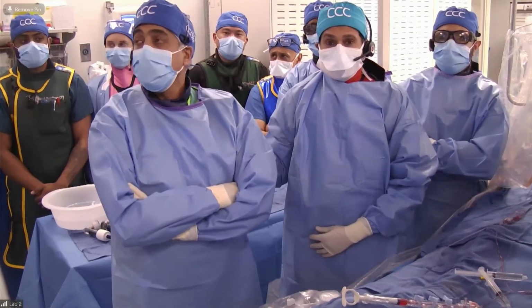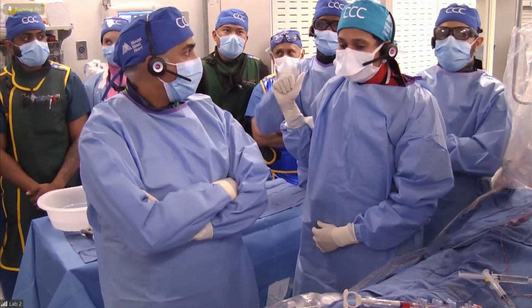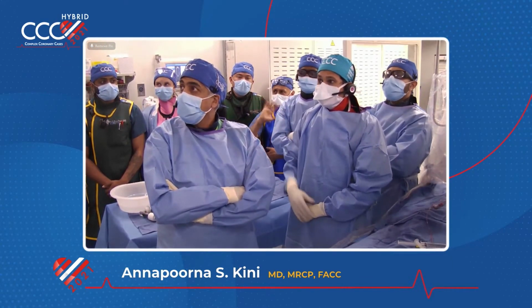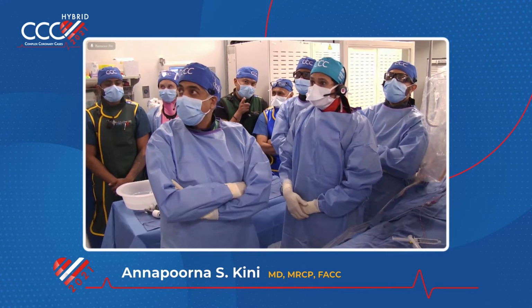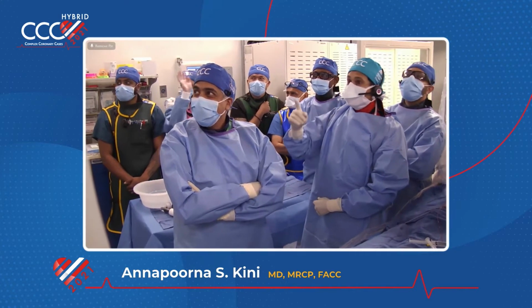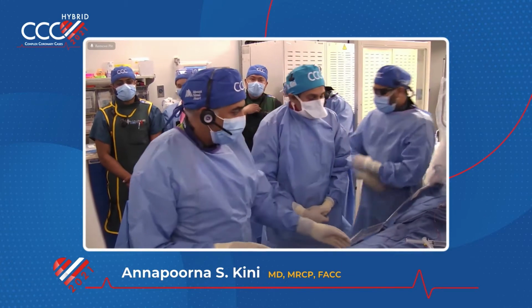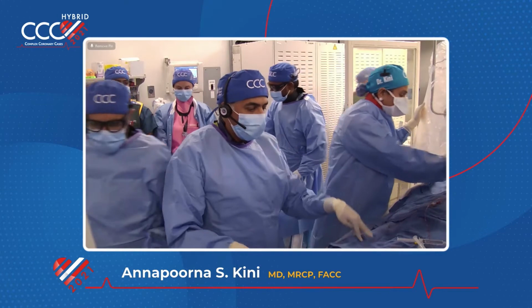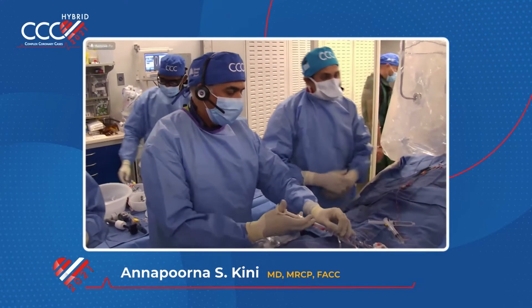I have Nitin Barman here and my two fellows, Mahi and Gurpreet. Hi, guys. And then we have Pablo, who is a chief tech. Will, who is a nurse here in this room. Then I have Christy. You can see her. And then Arna, who is another tech. So as you see how we are able to do all these complex cases because these guys are well trained and they know exactly what to do. Just with my eyes and my finger movements, they know what they have to do.